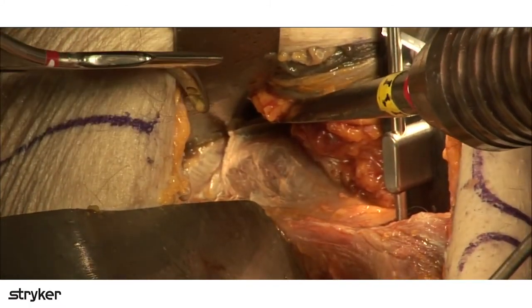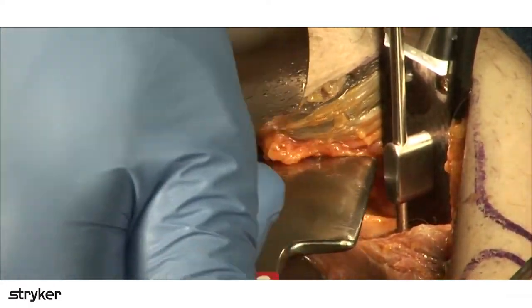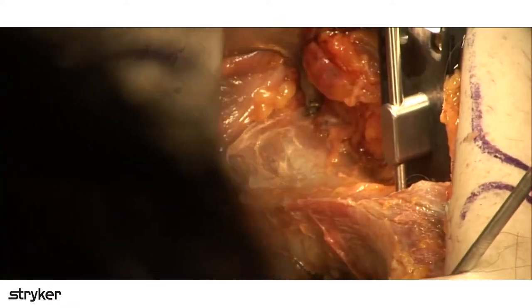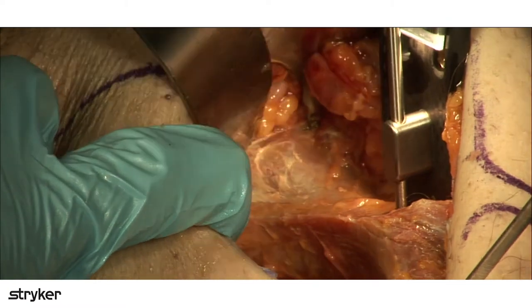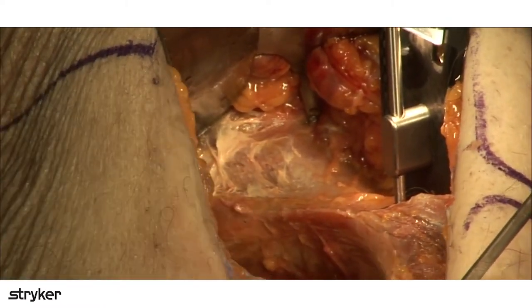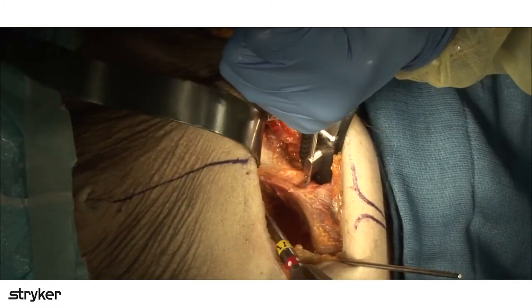So that is where you want to get out to, because that's a good place to put your next retractor, where you get in underneath the psoas into the psoas gutter. It's kind of at the base of the anterior wall, isn't it? So the next part of this is going to be coming up into the internal iliac fossa now.